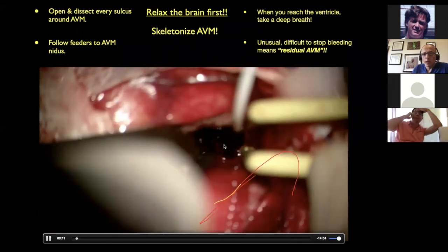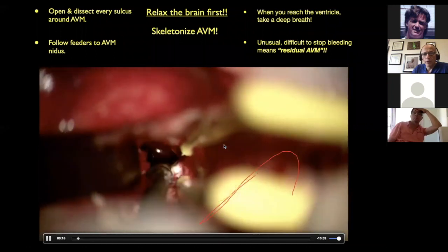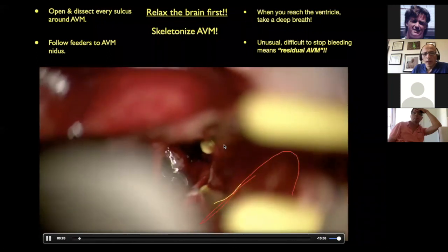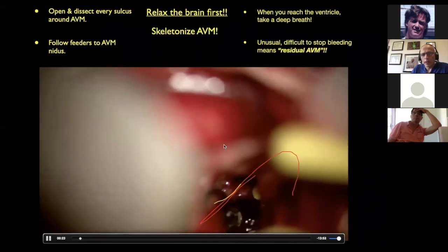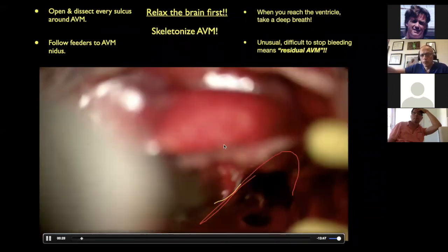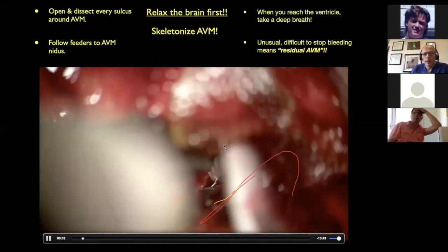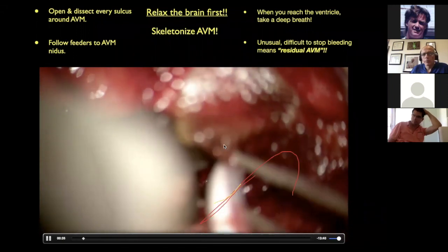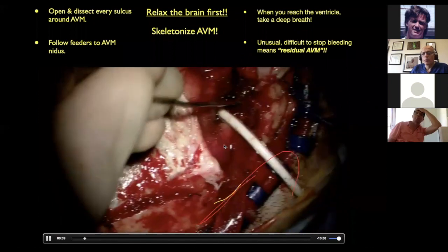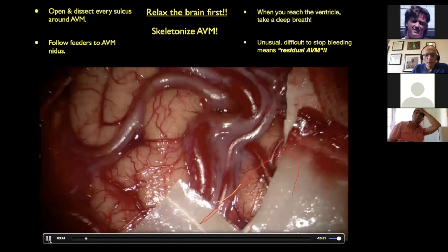I'm suctioning blood from the left ventricle, frontal horn, okay? And going, okay, I'm in the ventricle, getting the last pieces. I decompress as much as you can until you see all the way, and then under direct vision, I am putting in my ventriculostomy. And now the situation is better, the brain is relaxed, and the decision is, should we do anything?